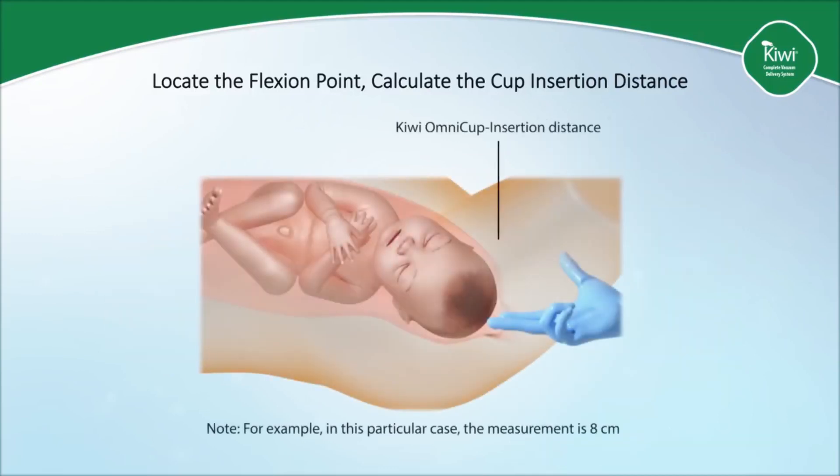With the knowledge of the length of one's finger, the clinician calculates the distance from the flexion point to the perineum by noting where the posterior fourchette makes contact with the back of the examining fingers when the tip of the middle finger is at the flexion point. In this particular example, the distance measured to the flexion point is approximately 8 centimeters. This is called the insertion distance.